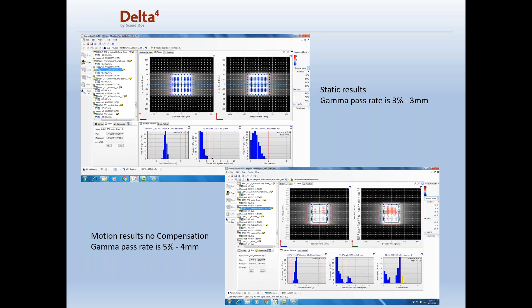The next pane in the lower right-hand side shows motion with no compensation. The gamma pass rate for this was 5% 4mm because there was motion but no compensation, and it created a larger PTV to cover the whole area.